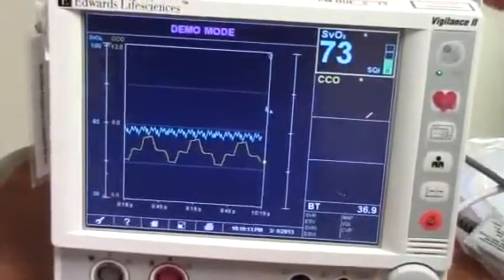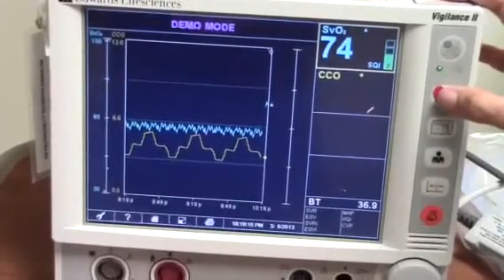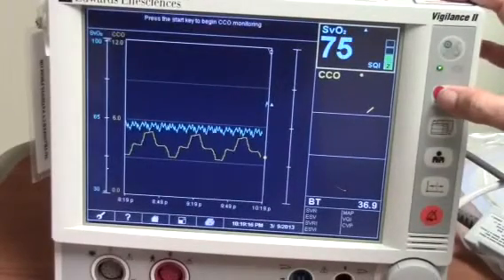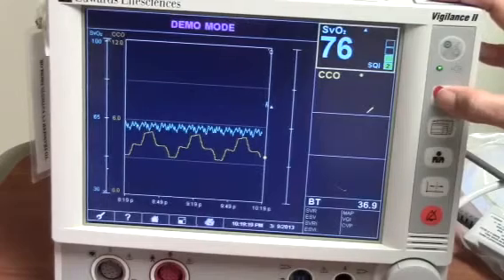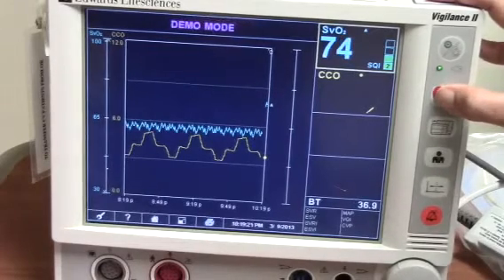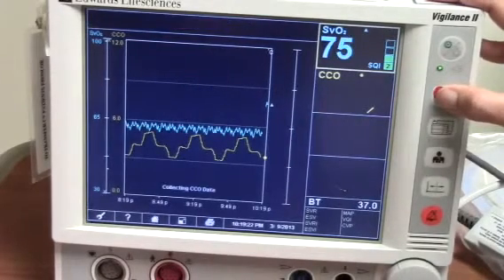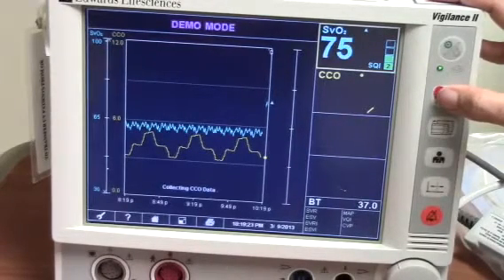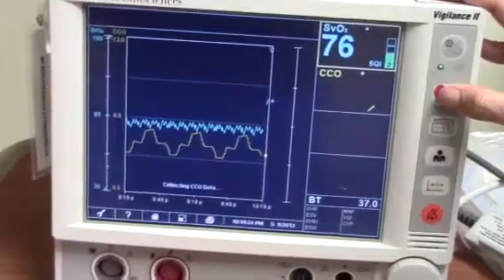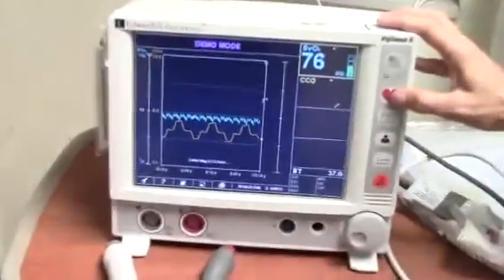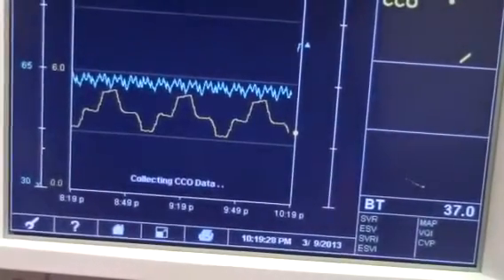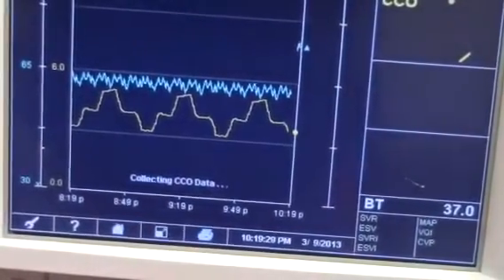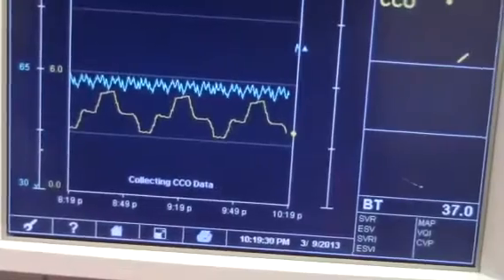Press the cardiac output start/stop button to begin the continuous cardiac output monitoring process. Collecting continuous cardiac output data is displayed on the monitor, which will take approximately three to six minutes.